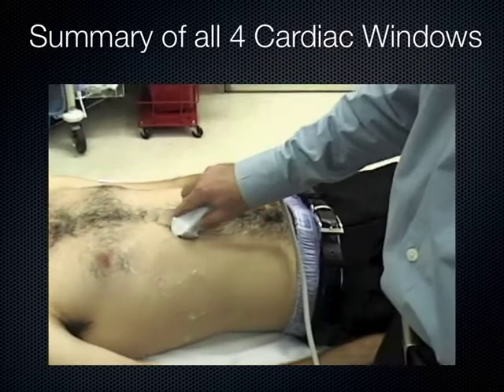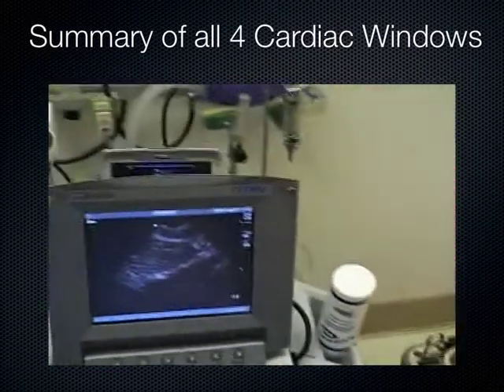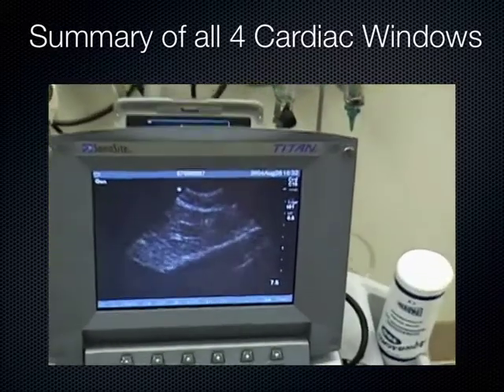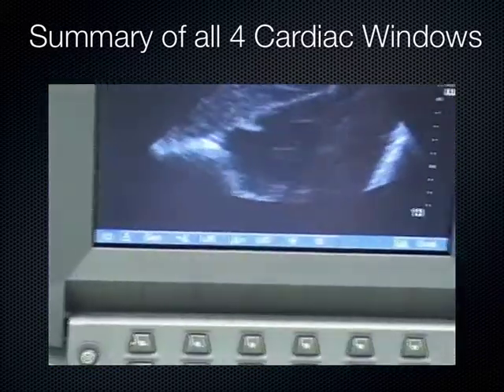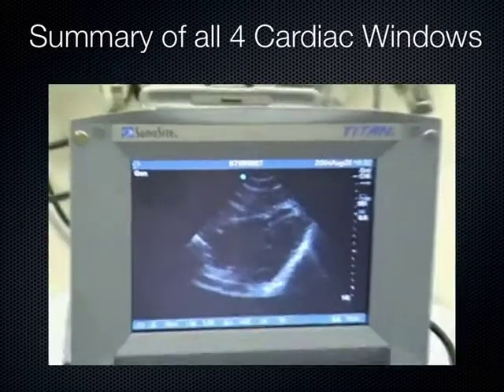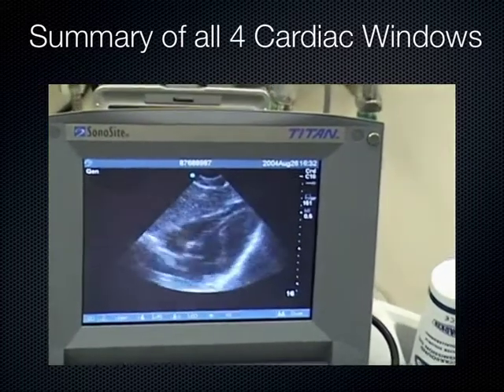And the first view I usually do is a subcostal view. Now if you look at the screen, what's the problem here? My depth is too low. It's at 7.5 and I'm just seeing barely part of the right ventricle. So I want to go down on the depth. In fact, when you do a subcostal view, you want to go down quite far on the depth. And the screen looks a little dark to me. I'm going to turn up the gain a little bit here now.